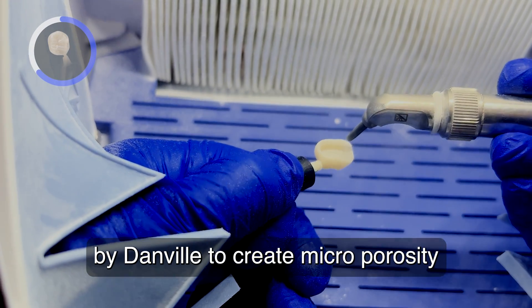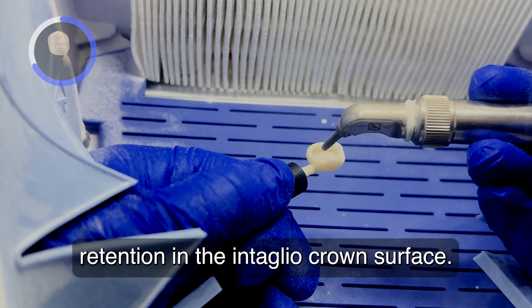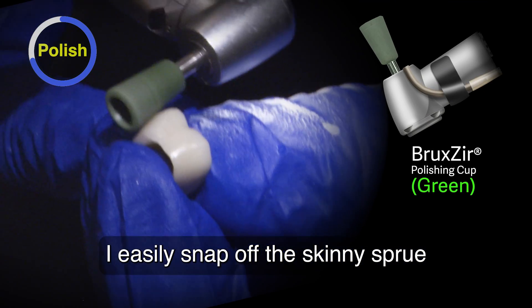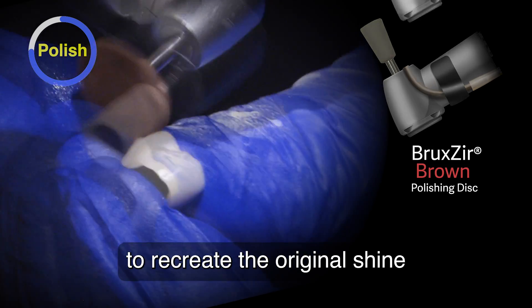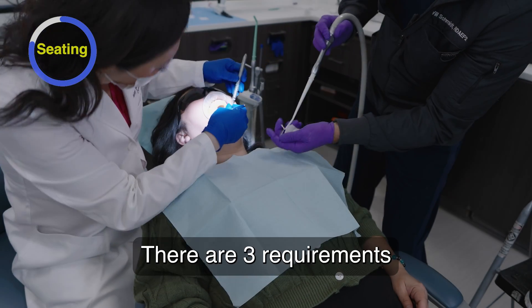I use a chairside air abrasion system by Danville to create microporosities for enhanced micro-mechanical cement retention in the intaglio crown surface. I easily snap off the skinny sprue and quickly adjust, finish, and polish the proximals and occlusal contacts to recreate the original shine using the Bruxer Adjusting and Polishing Kit.